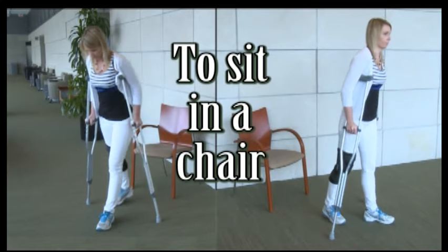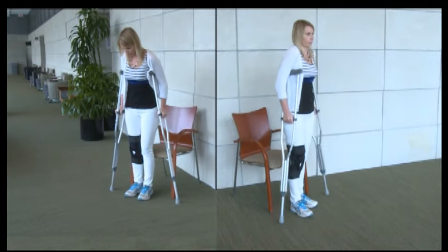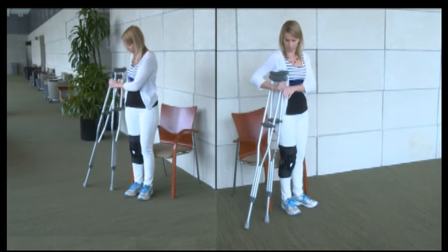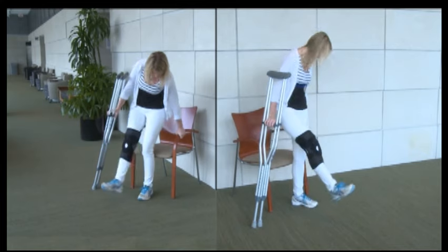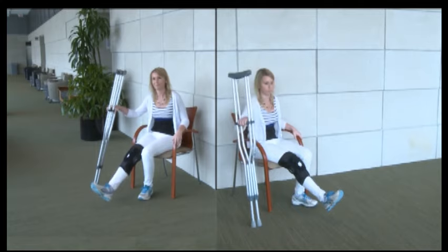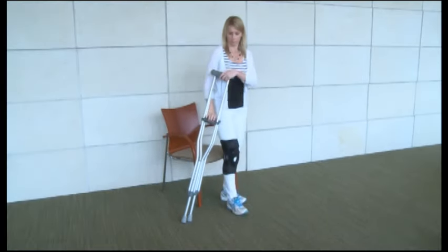To sit in a chair, back up until you feel the chair on the back of your legs. Place both crutches in the hand of your injured side. Hold your injured leg out in front of you as you reach back for the chair with your other hand. Lower yourself slowly to the chair, bending at your hips. Do the reverse to stand back up.